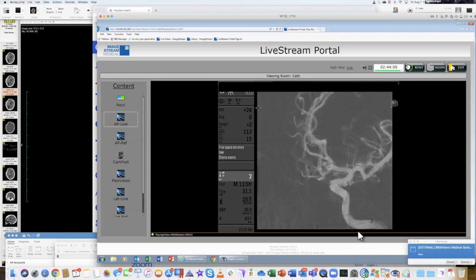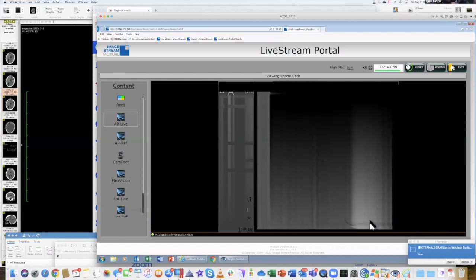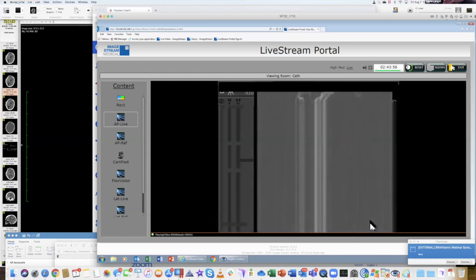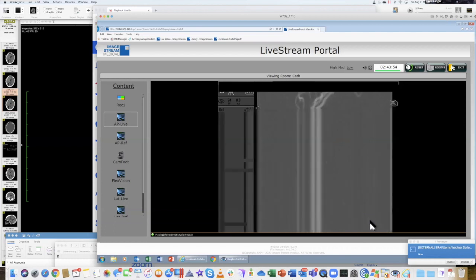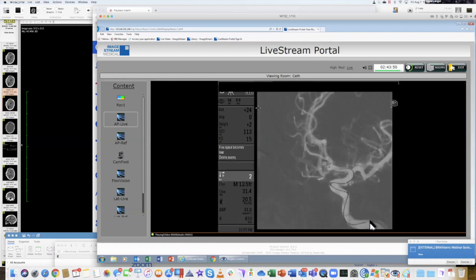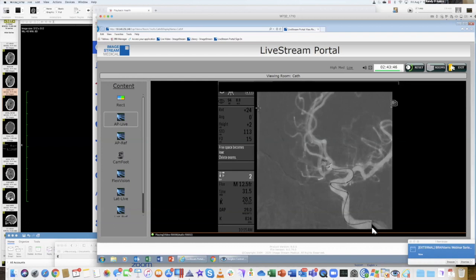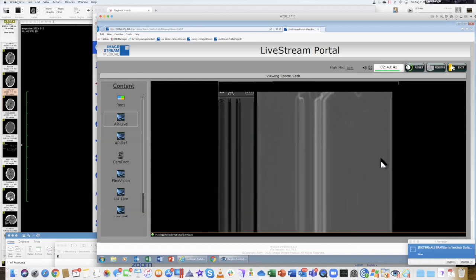The key is you need support. The tip of the catheter in here is very, very flimsy, so that's why you have to have larger catheters down low. We sort of stack the support on the way up because you need something firm to press against. If it's really flimsy and you're pushing all the way down from the groin, you're not going to have anything to push against. So we put a larger guide catheter up first. That gives you some support down here. And then we pass the microcatheter up inside.